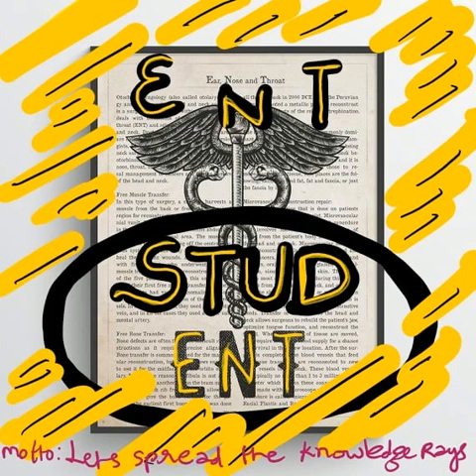So the digastric ridge is exposed by drilling the inferior area of the mastoid tip bone, thinning it by removing medial and lateral tip cells. The ridge runs anterior to posterior and lateral to medial, starting inferior to the sigmoid sinus and ending at the stylomastoid foramen. The anterior end of the periosteum of the digastric muscle forms one of the landmarks for the facial nerve.